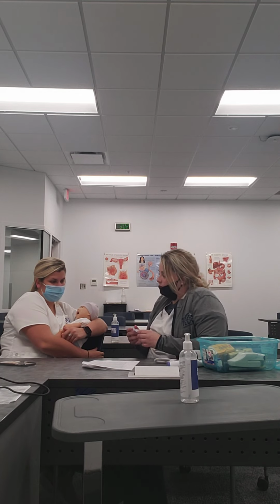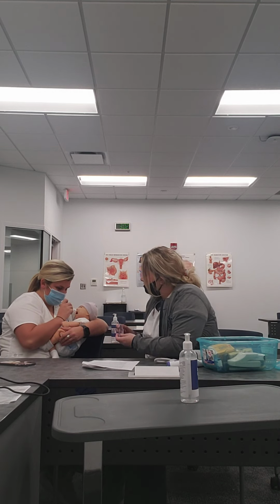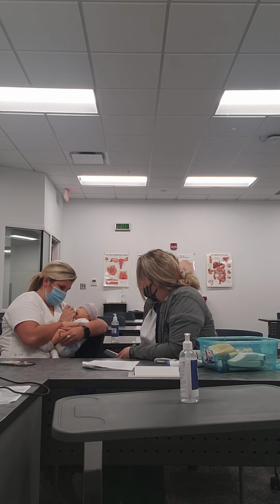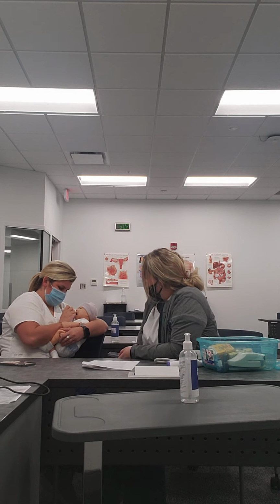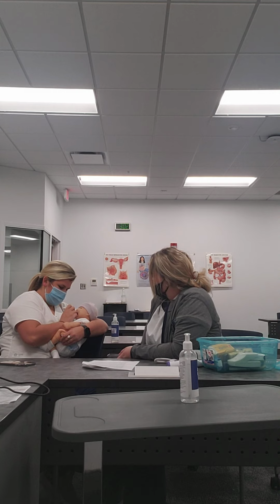Right. So, do you want to try it? Sure. So we're gonna get your temperature. He's so good. All right, 96.4. Okay.